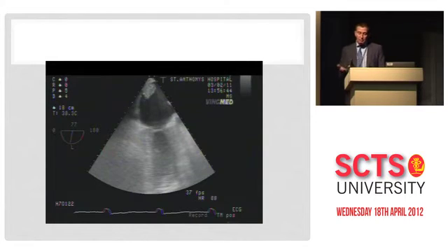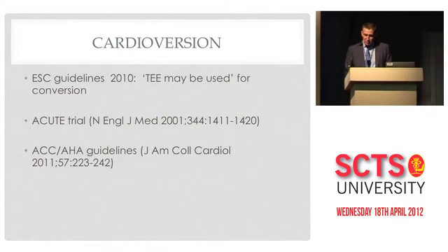And this was a very powerful illustration to me, as a budding intraoperative echocardiographer, of the value. And I think we can all see how much the expense of not picking this up would be. That would buy me 6 3D probes, 2 machines, and probably dinner for 2 at the best restaurant in Manchester, the entire cost of the NHS of treating that gentleman.